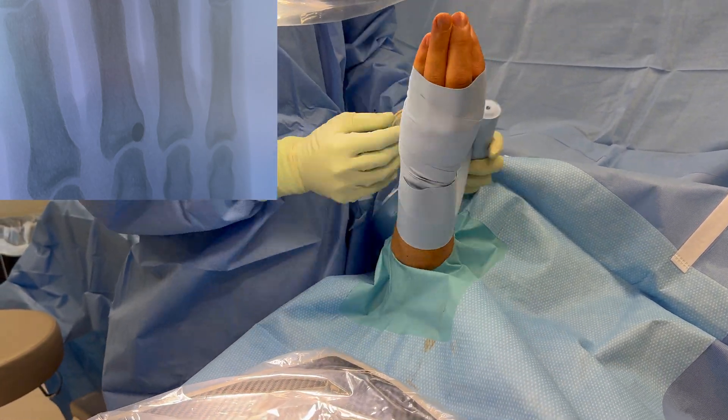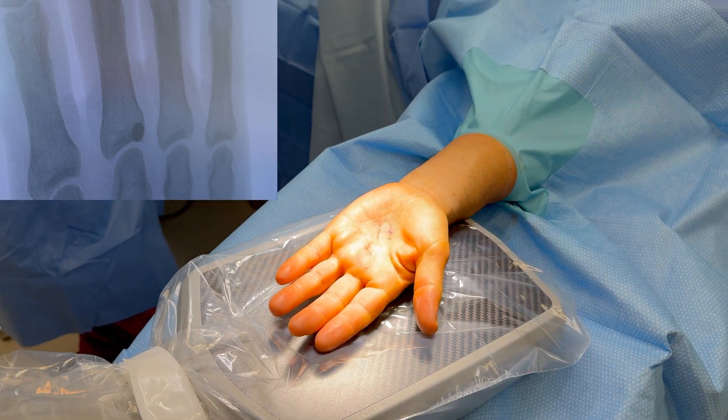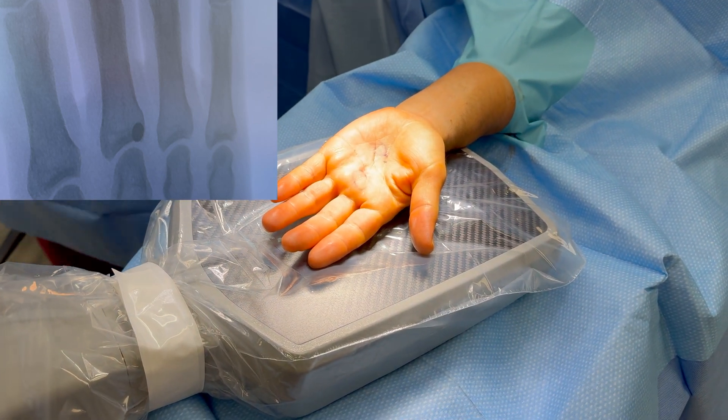We use an Esmark and then a tourniquet to limit the blood loss. We typically put our tourniquet up to about 250 millimeters of mercury.